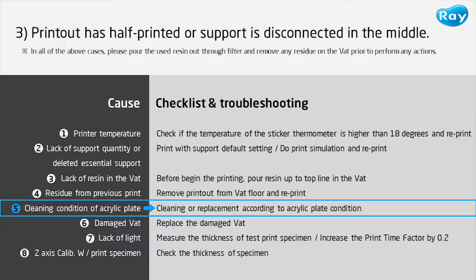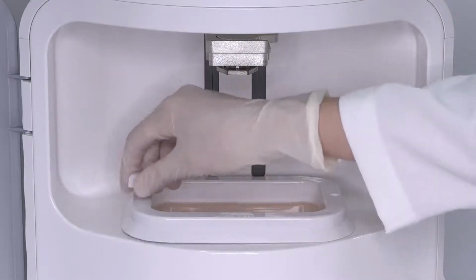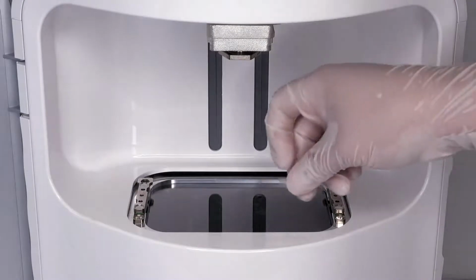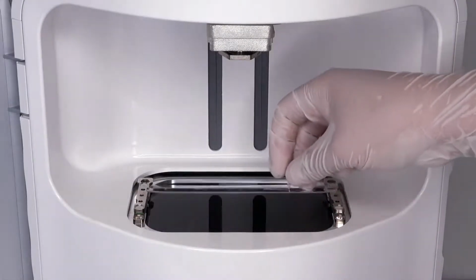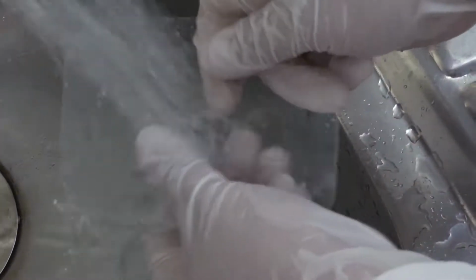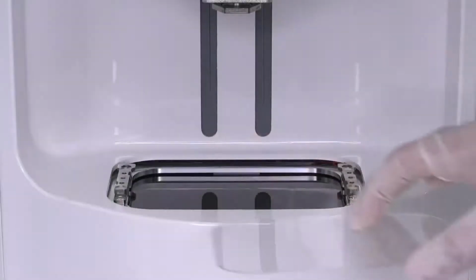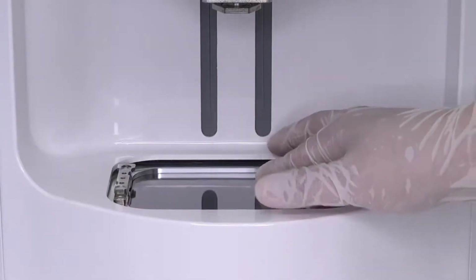The next cause is the cleaning condition of the acrylic. After removing the vat from the chamber, remove the acrylic plate with regular adhesive tape and check the contamination level. If it's possible to clean it with water, wash it and reuse it. If it's not, replace it with a new acrylic plate.